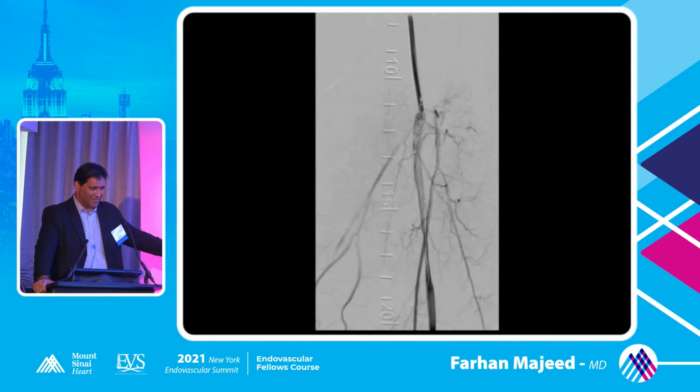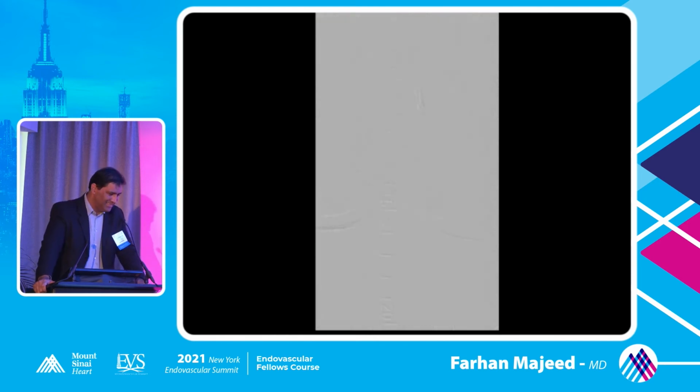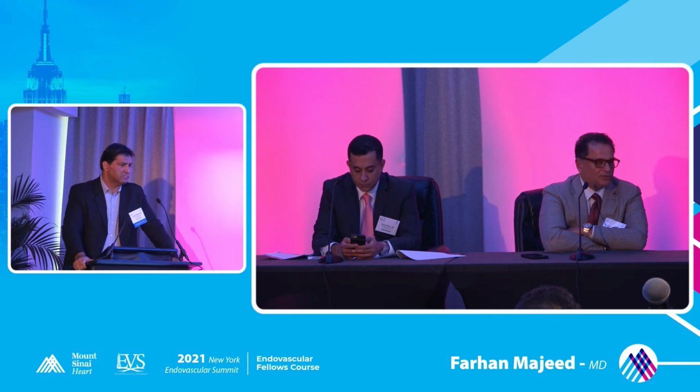This is a PK special. He has taught me a great technique, and he does this all the time, so I want him to talk to you about it. Yeah, so basically you go in with a catheter. You can use a Penumbra, which is very expensive, or you can use a multi-purpose. For the sake of Penumbra, since they're here, it's approved to do it, so use a Penumbra.